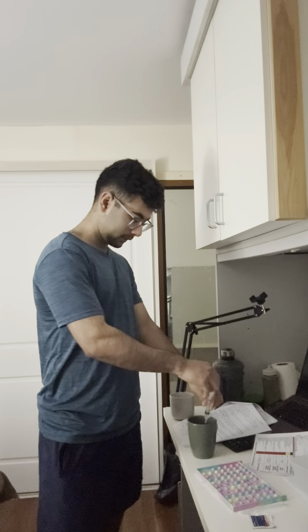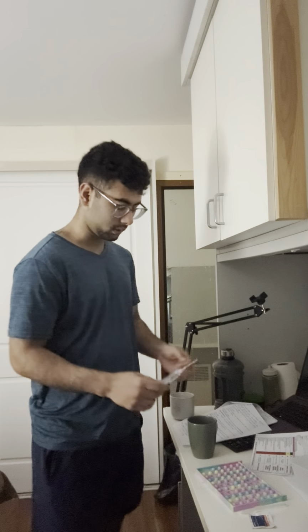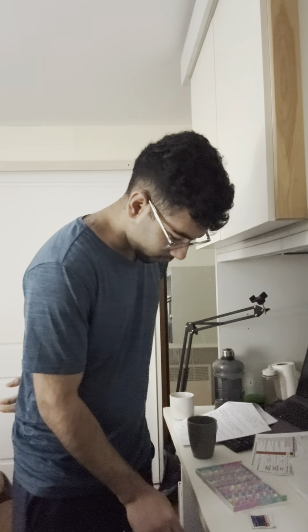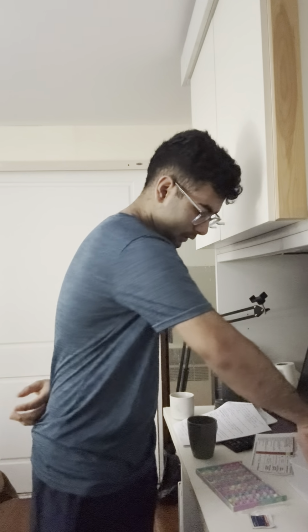And after that, you're gonna come to the patient medication room for your first check, and you're gonna take all the things that you need. You're gonna take out from the drawer, and then you're gonna start assembling it. You start making it, right? So you're gonna call the RN for second check, and she's gonna check how good you are doing. So I'm gonna draw the second needle as well. For example, I am with the RN at the moment, and the RN is looking at me how I'm drawing the needle, right? All one hand always in the back, and you're gonna take it like this.